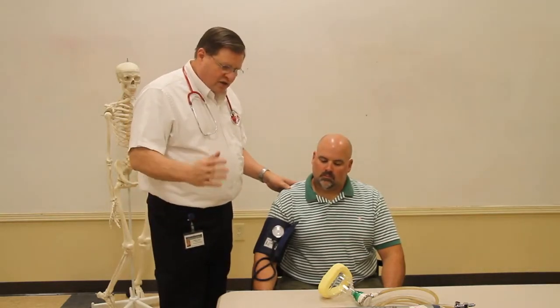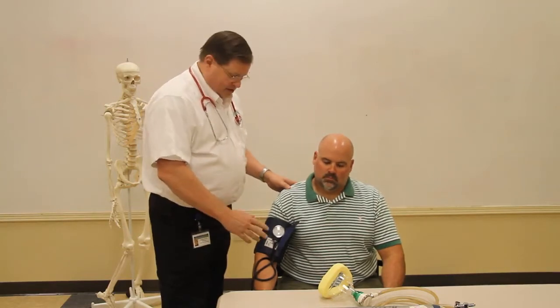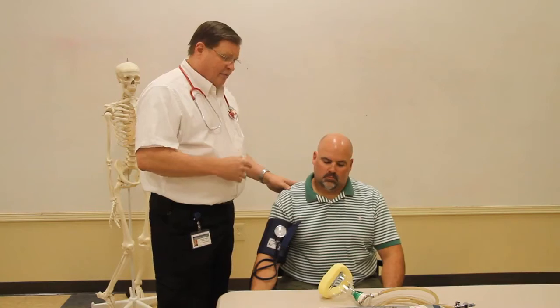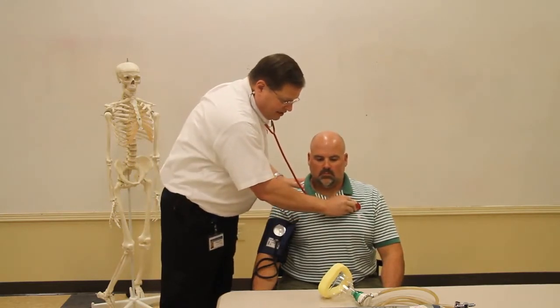The next thing that we want to do is obtain vital signs. We'll use a blood pressure cuff and stethoscope, take his pulse, and take his respirations. Along with his respirations, because we are dealing with the respiratory system, we're going to auscultate breath sounds. When we auscultate breath sounds, we're auscultating up in here.